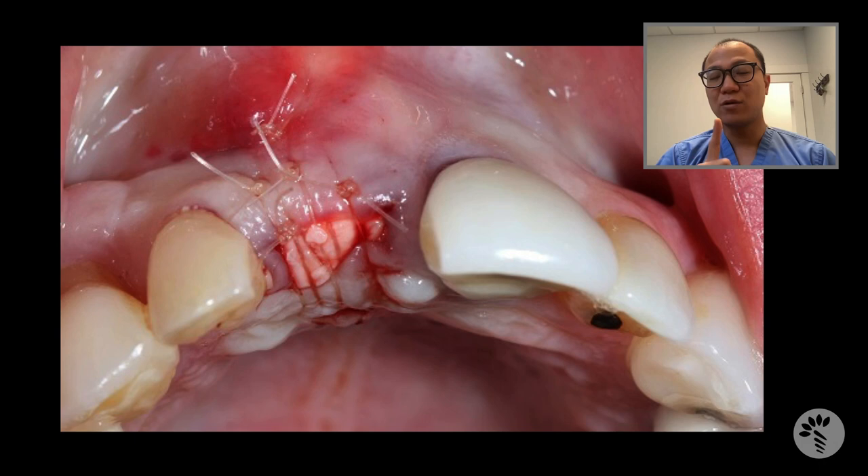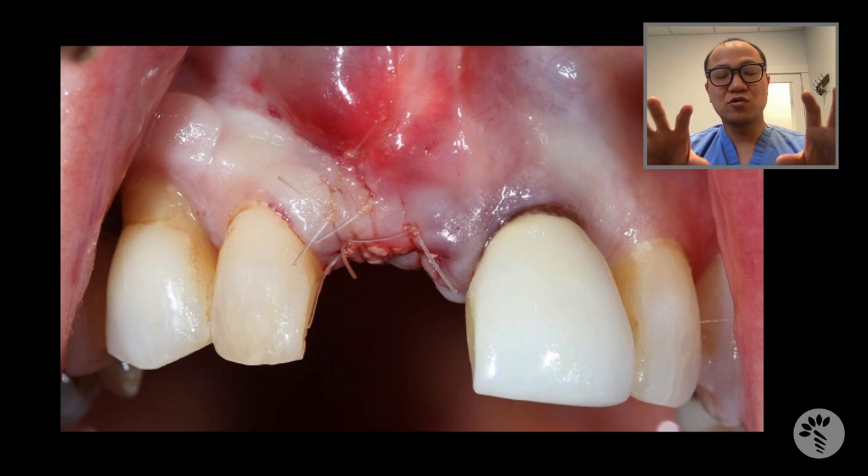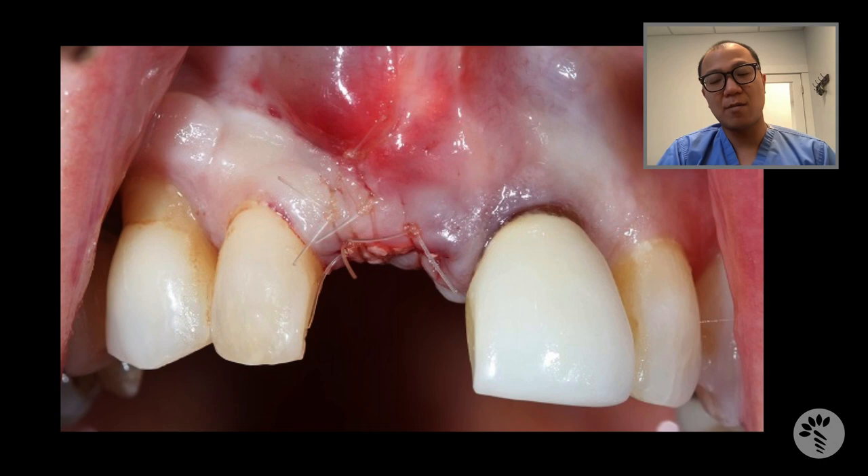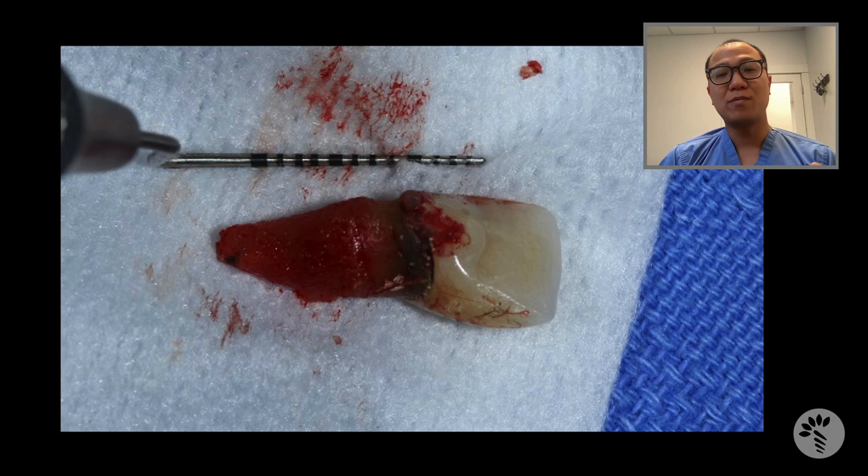This means there will be less chance for the membrane to be contaminated by saliva and food, and it will take less time for the soft tissue to completely close. This is how it looks from the frontal view — you can see it has been done really nicely. In this case, I use 5-0 monocryl suture, which dissolves in the mouth in about four to six weeks, because I want to make sure during that healing time the sutures do not prematurely resolve to the point where the flaps start opening up. At the end of the extraction, I always measure and take a photo with my periodontal probe. This gives me some idea about the length of the socket, which helps me decide the length of the implants. Obviously with a CT scan we don't have to rely solely on that, but knowing the tooth length before extraction always helps me plan the size of the implant.